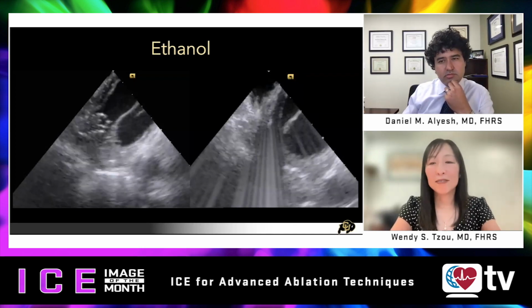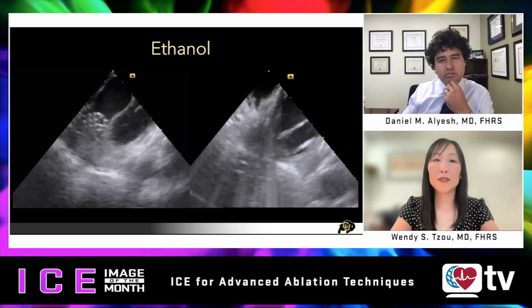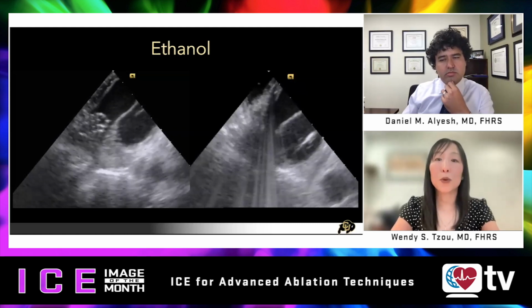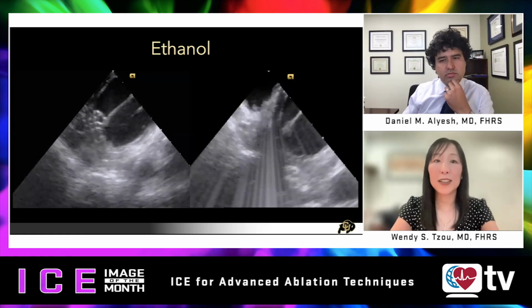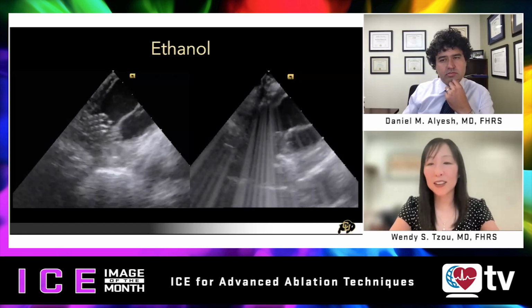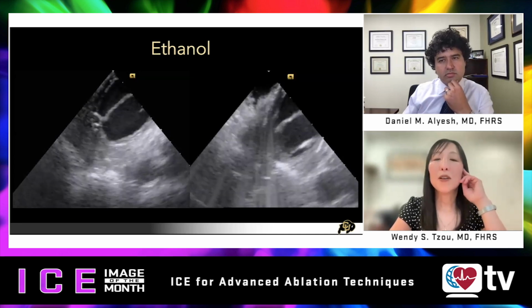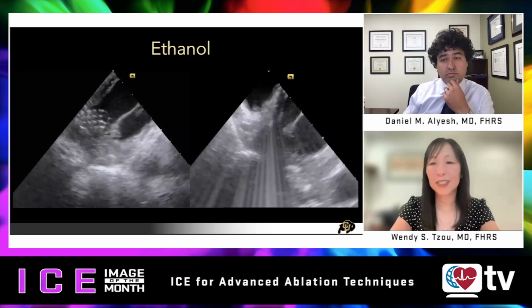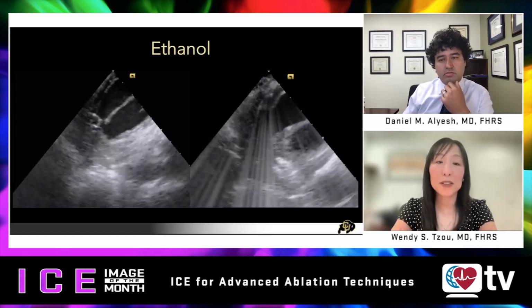I don't know if that specific lesion will translate into a durable lesion of comparable size. Again, Miguel has done some studies with MRI to correlate that there is still a reasonably sized LGE that is identified on cardiac MRI post this type of procedure. I haven't done that yet to correlate with ICE, but I think this plus the clinical result is what I'm aiming for. Really, this is just to use it as I do in the RF ablation setting, to see that a lesion is effectively formed. And I've convinced myself that I think that's real.